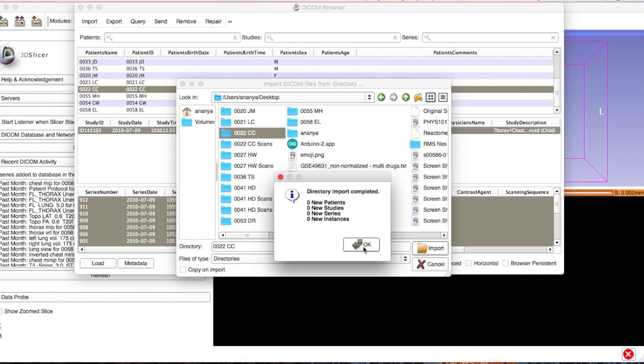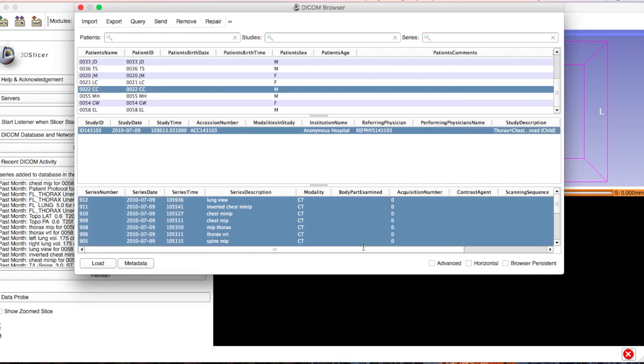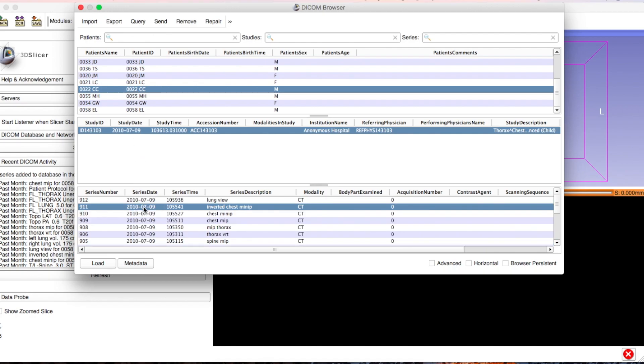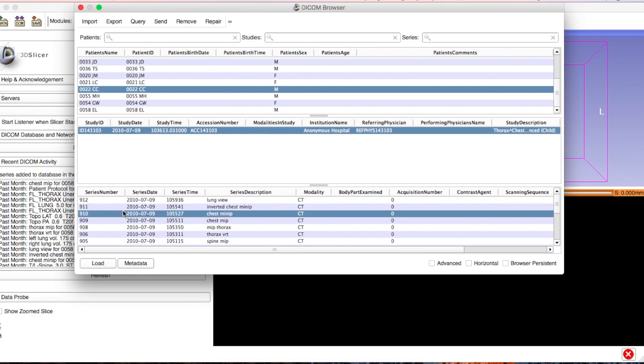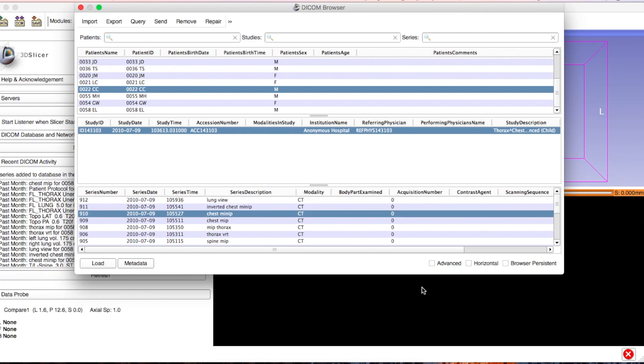The reason it shows zero on all those numbers is because I've already uploaded this once, so there are no new files being added — but those numbers will change if it's the very first time. Just click OK and now you have that file and all of the scans under it. We're going to go through each scan and determine which ones are good and which ones are bad.